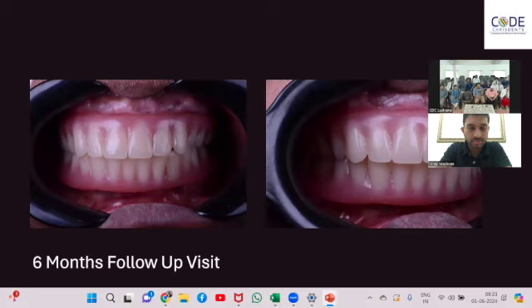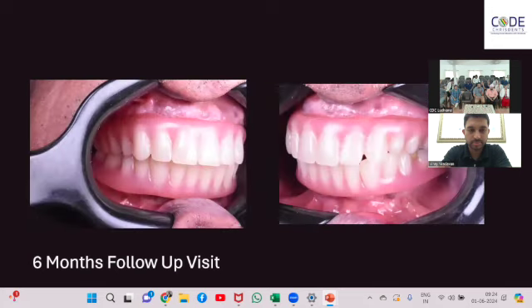And luckily, none of the acrylic had debonded. There was no fracture of the acrylic, and we were really happy with how the acrylic held on to its positions. In some of these cases, they can come back horribly, with a lot of teeth breaking, midline fractures. Even without any framework or metallic backup, this was in position, partly because of the good occlusion we had.